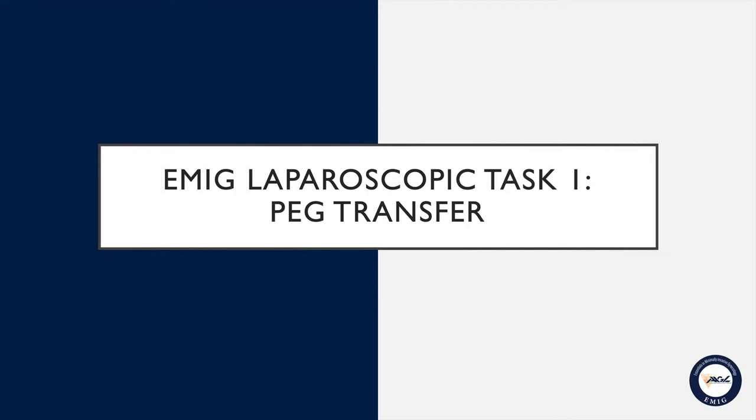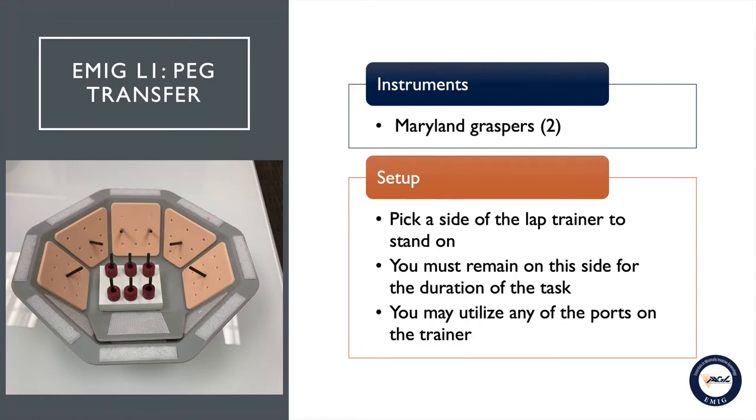EMIG Task Number One: Peg Transfer. For this task, you will be provided with two Maryland graspers. You are required to pick a side of the lap trainer to stand on. You must remain on this side for the duration of the task. You may utilize any of the ports on the trainer to perform this task.